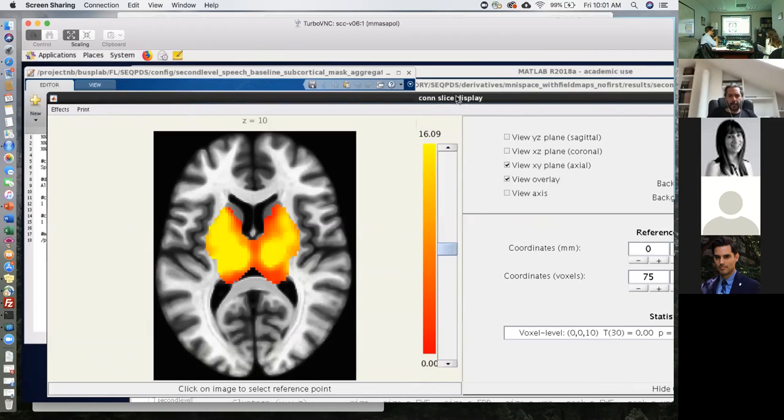So you're saying that I need to rerun the first and second level with this one? No, the first I left it. I don't know. I wanted to run this by you. What do you guys think?